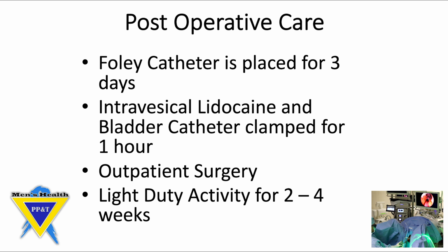This is typically performed as an outpatient procedure. A Foley catheter is placed for 3 days. Typically, the catheter is clamped with intravesical or intrabladder lidocaine to help numb the area and allow for better pain control afterwards. Most patients would typically be recommended to be on light-duty activity for 2 to 4 weeks until their prostatic urethra has time to heal.